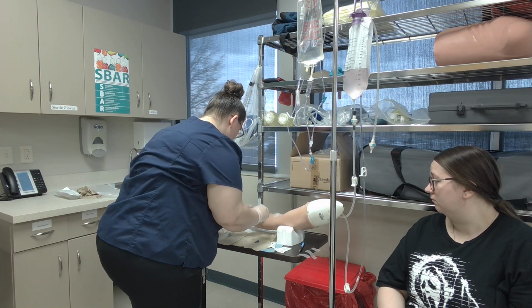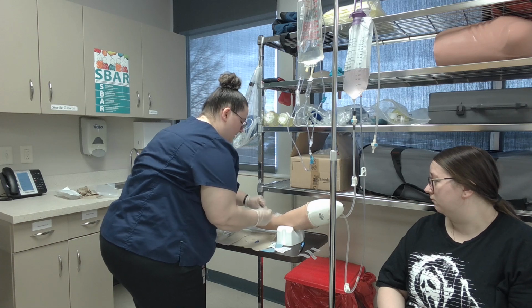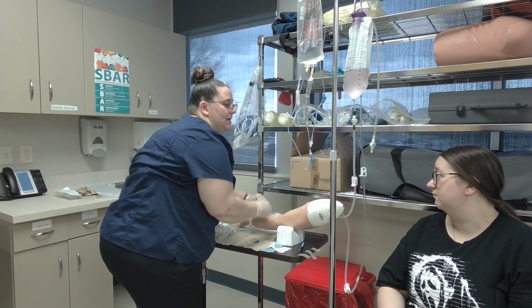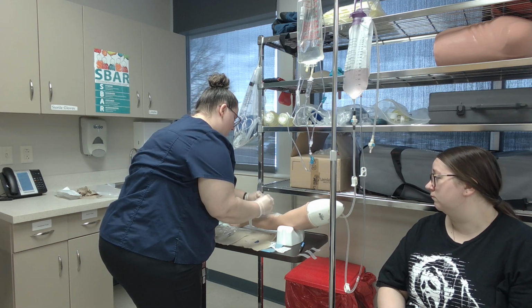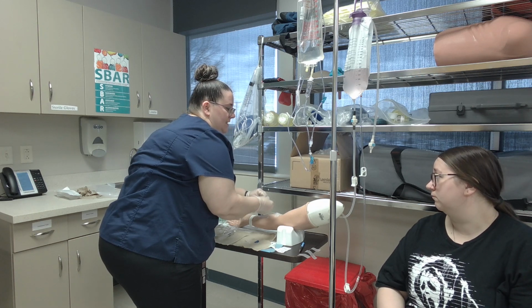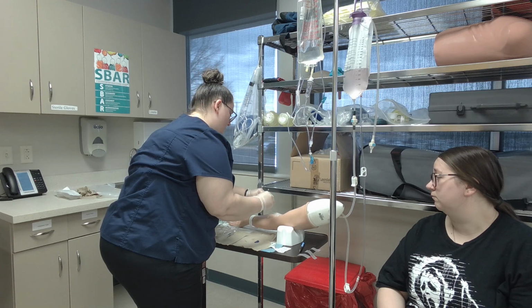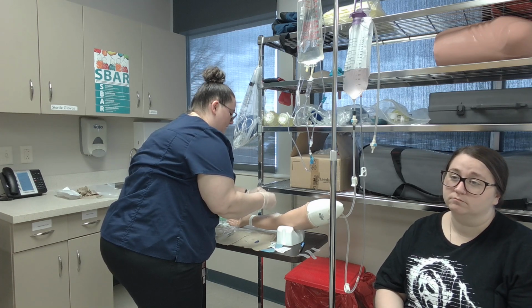Scrubbing the hub. Okay, 30 seconds. Here we go. And then while I'm doing this, I'm going to state that I will come back in 10 to 30 minutes to check for adverse reactions. If I notice any adverse reactions, I'm going to notify the prescriber, notify the pharmacist, discontinue all of the medications. I'm going to assess vital signs and document everything.